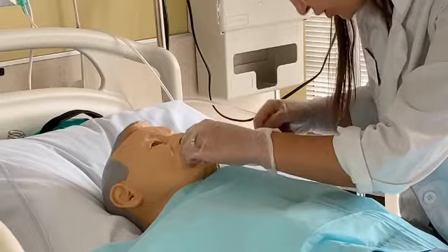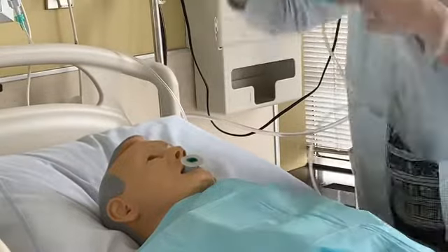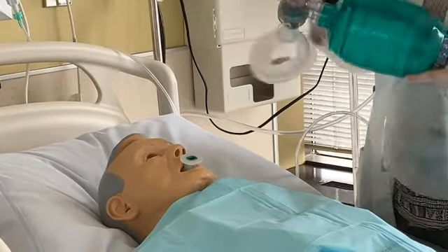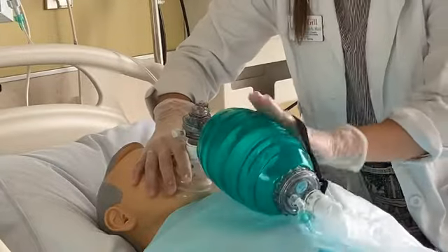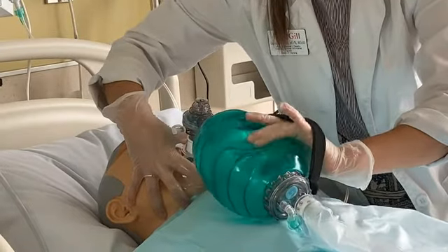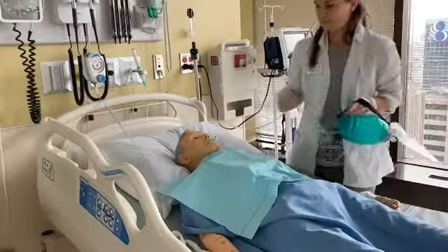I see that there are no new secretions, and I can try ventilating to make sure that there are no obstructions anywhere else. So I can take my ambu bag, I make sure that it's plugged into oxygen, wait for this to inflate, and I can try ventilating the patient. And observe for the chest rising. So I observe the chest rising. It's very easy to ventilate, and I don't feel any obstructions.